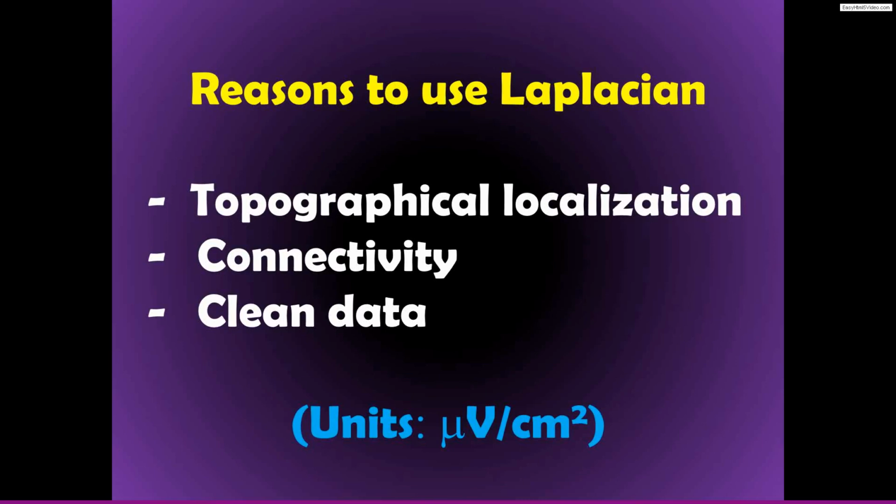I don't think this is necessarily mathematically the case, but empirically it seems to happen very often. You will often find that your results just look better and cleaner if you apply the Laplacian compared to just doing it on the raw voltage data.